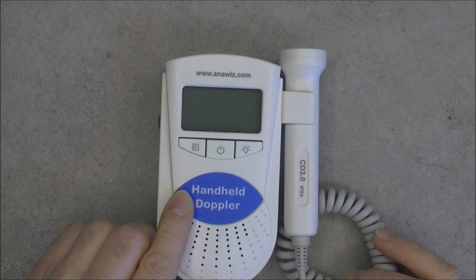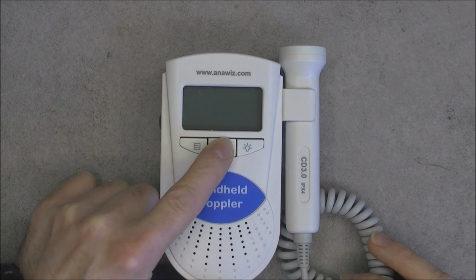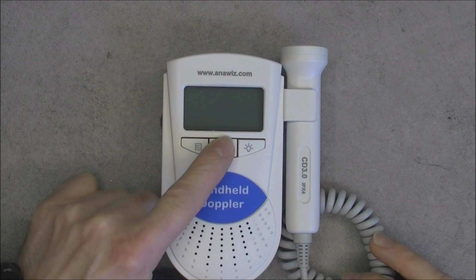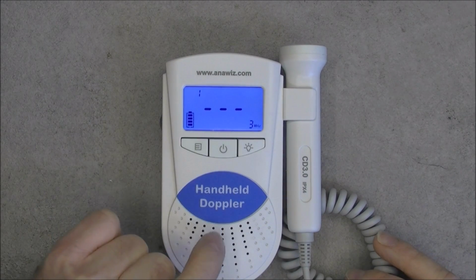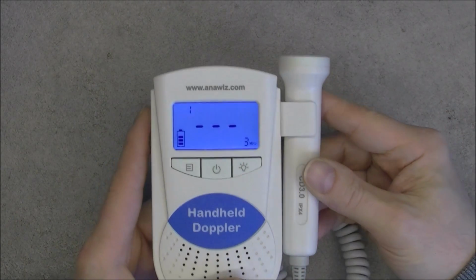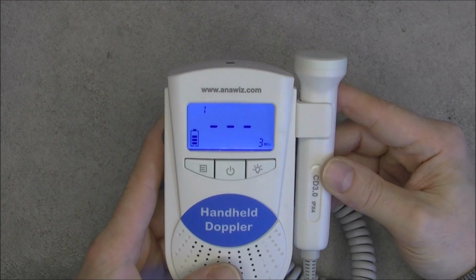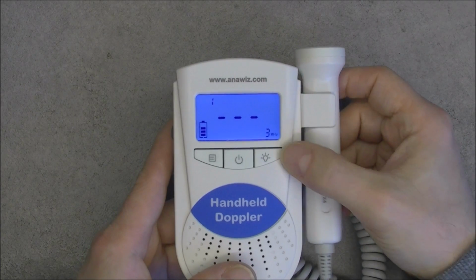So it seems it is not working. First, if I just press the power button a little bit, it will make a click noise, but it will not power on. If I press a little bit longer, it will power on. You can see we have a very nice blue backlight. Apparently it is sold with different probes. This one is the most common one, a 3 MHz probe.